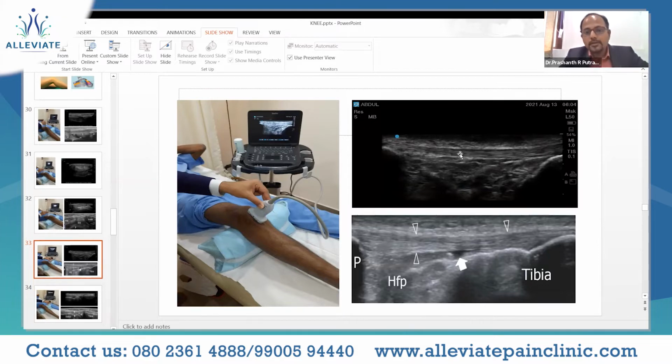What is more important, again, is to avoid anisotropy. We have to be exactly perpendicular to that structure, and then we have to move around to the sides as well, because when we are doing a sagittal scan, we are at the center of the tendon. So you have to move a little right and left to evaluate the tendon as a whole, and also turn the probe 90 degrees so that you can evaluate it under a transverse scan as well.